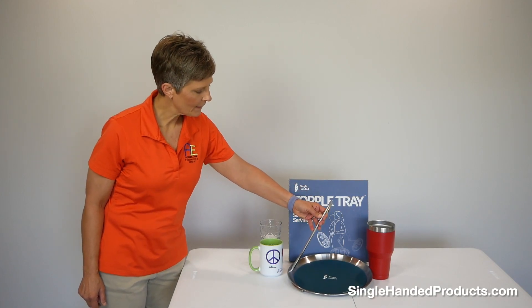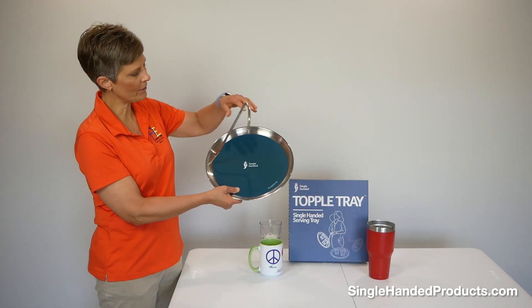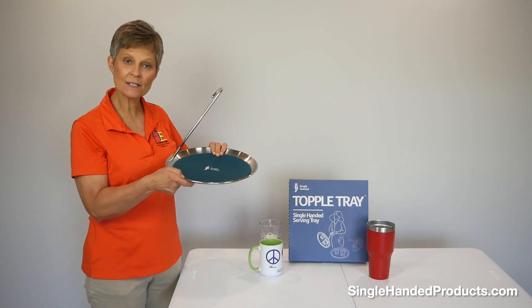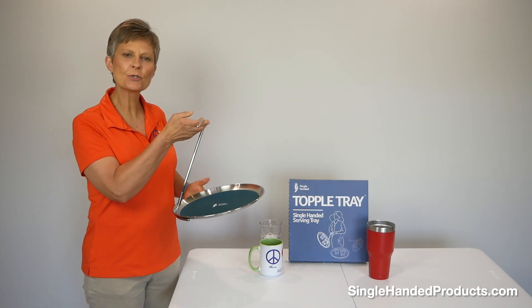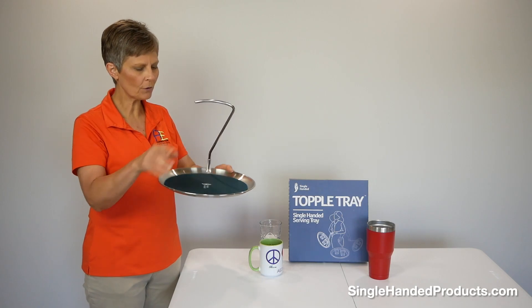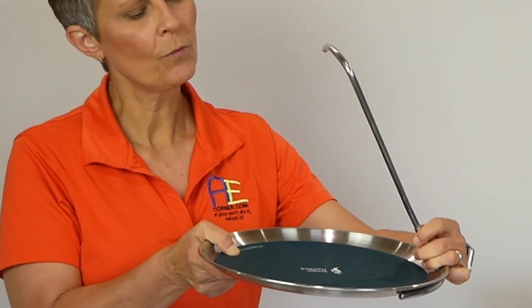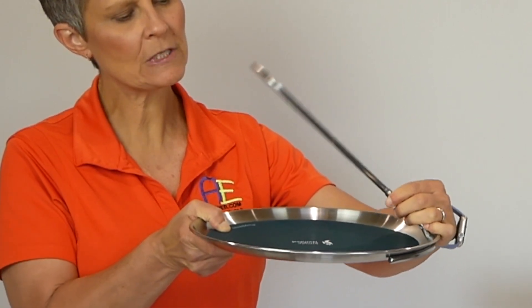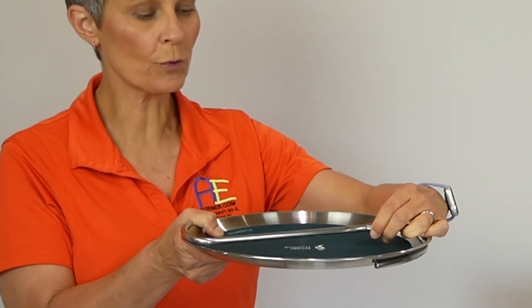This is the Topple Tray. As you can see, it is a round tray — 30 centimeters in diameter, made of stainless steel, and weighing approximately 2 pounds. This handle will fold down. The way you do that is there's a little metal tube right here. If you lift that up, this handle will fold down flat for storage.